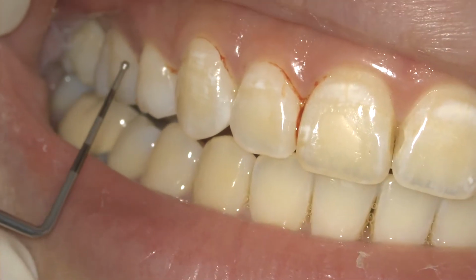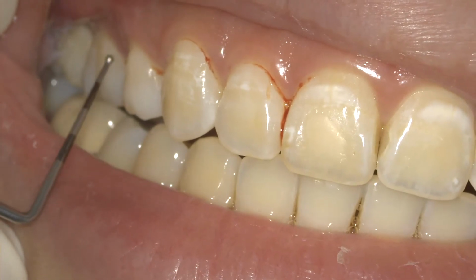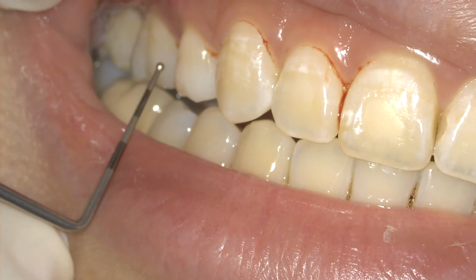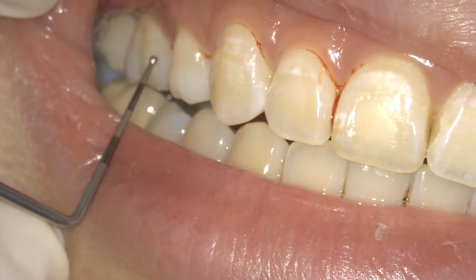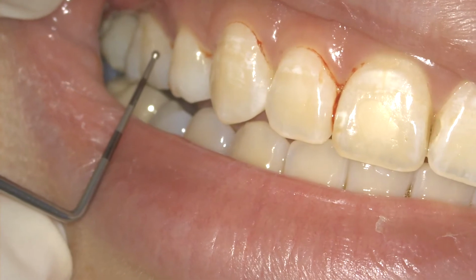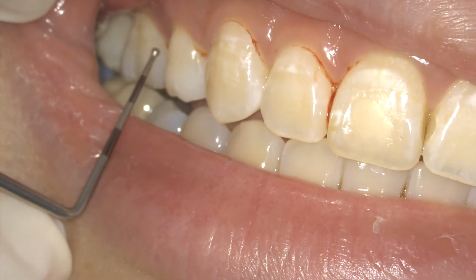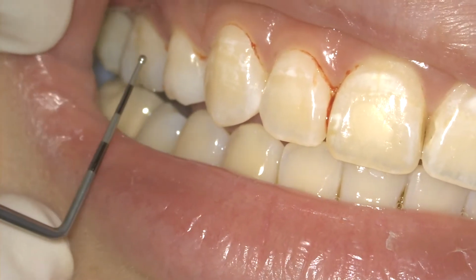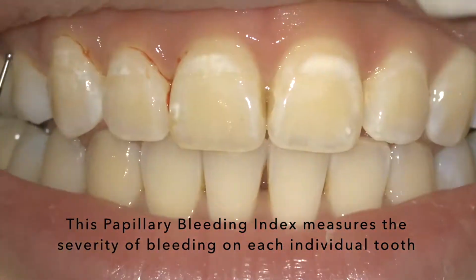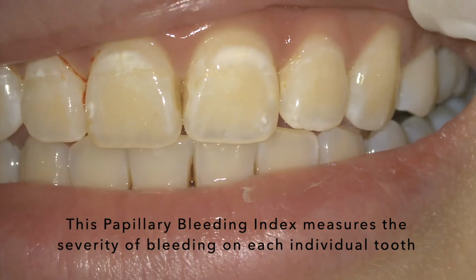In this case, the entire interdental triangle, the embrasure space, is almost filled up with blood. It's not too heavy, but it is there. So I will give a score of 3 in this situation. So like this, you will actually assess the severity of bleeding using the papillary bleeding index.